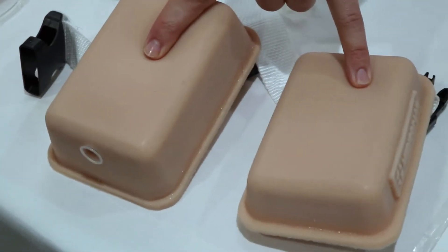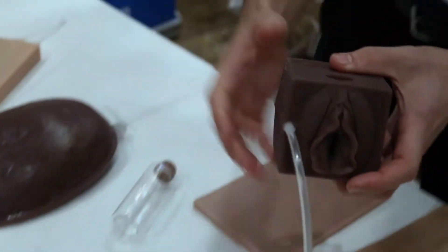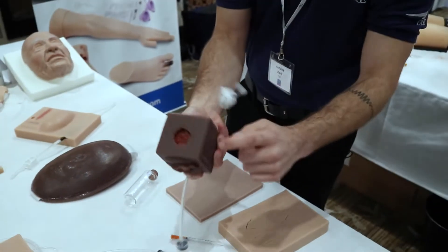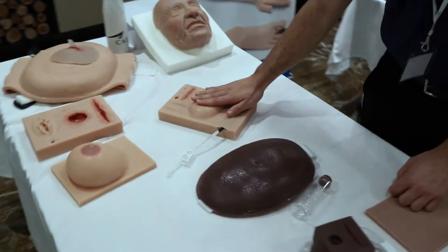We have a variation of injection pads with an intradermal pad as well. We have trainers for distance learning — this is our multi cubes with various tasks to be learned on this one, as well as our multi pads here.